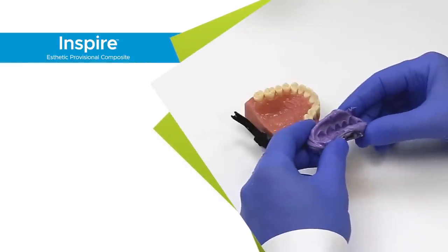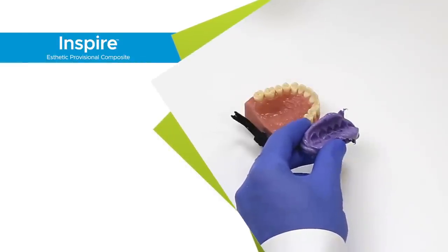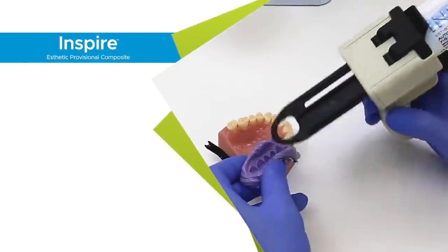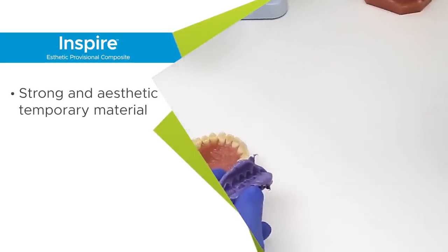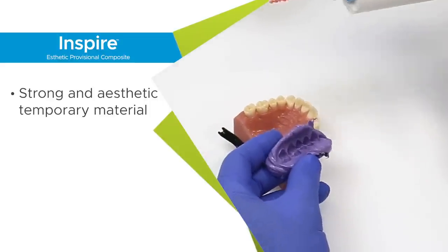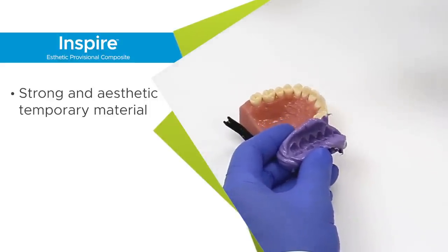We have now prepared the tooth and we're ready to make the temporary crown. In this case, we are going to use Inspire Aesthetic Provisional Composite, a very strong and very aesthetic temporary material from Clinician's Choice.